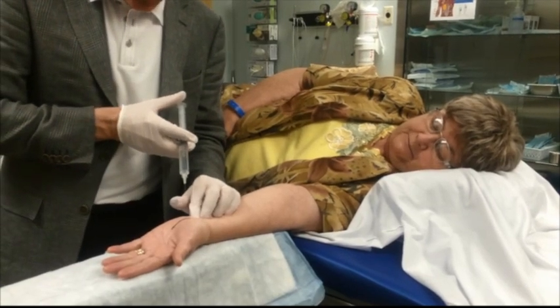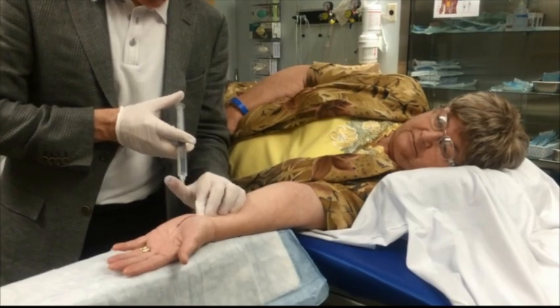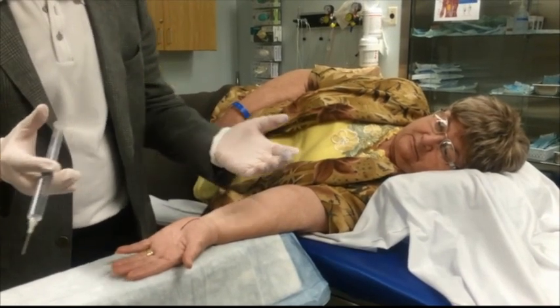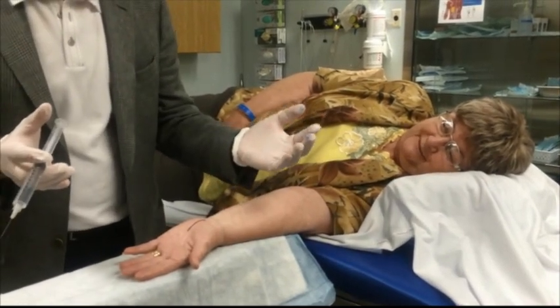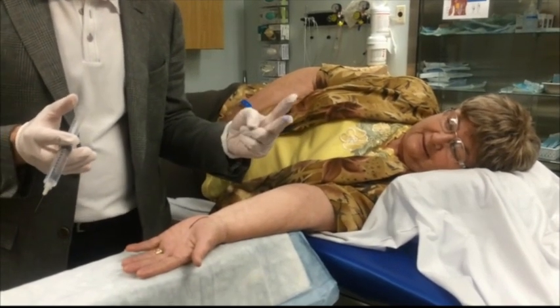I never want to elicit paresthesias — you only do that to people you really don't like, and I really like Mary. So there's only one rule about the freezing, and that's the don't move rule. Because it's normal when somebody sticks a needle in you, you want to go 'ouch.' But if you go like that before I get the medicine in, then I've got to stick it in again, and it hurts two times.